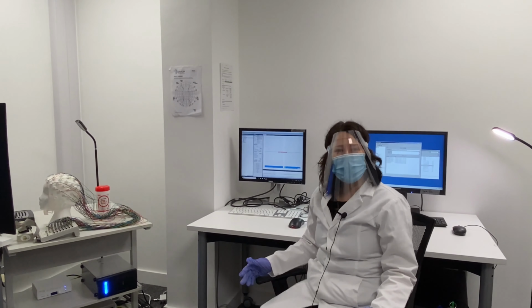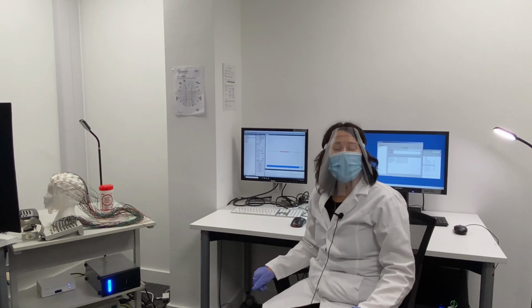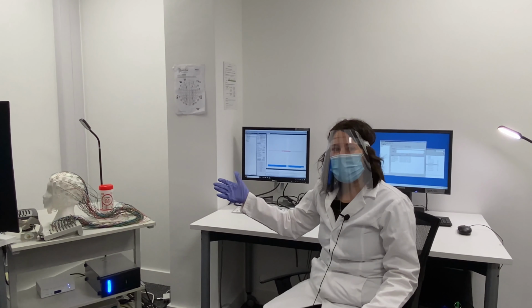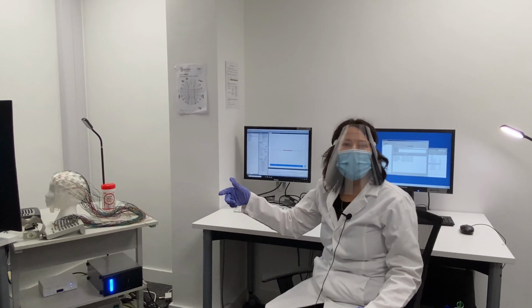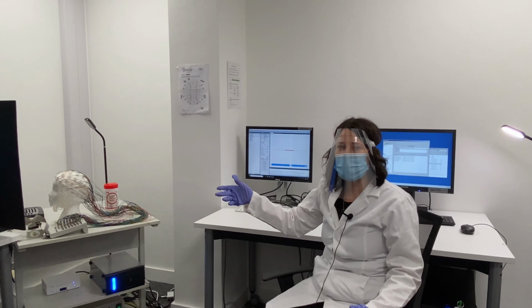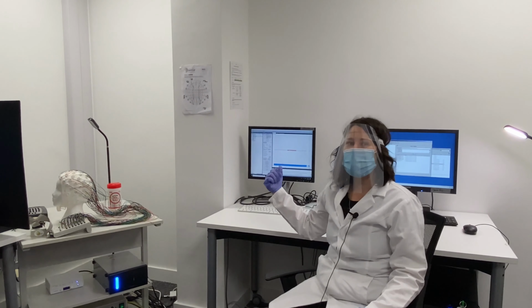This is our EEG lab. In here, we are doing our experiments and we're recording brain activity via our EEG cap with the electrodes. Our participants are sitting over there on the computer and they are performing different experiments, auditory or visual experiments. And then we can record the brain activity and visualize it over here on the screen.